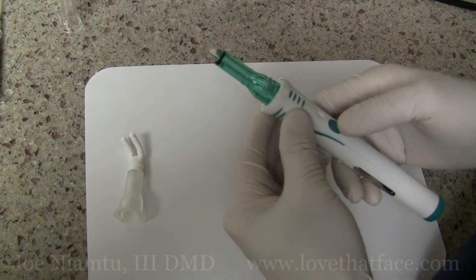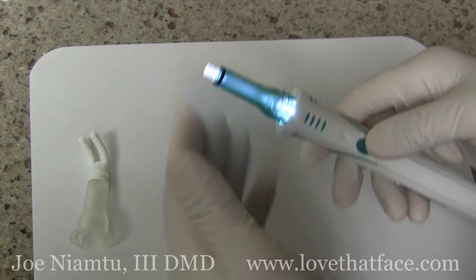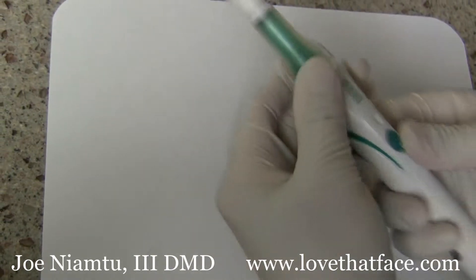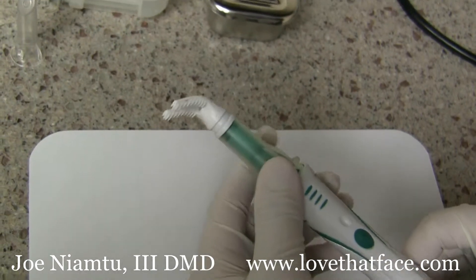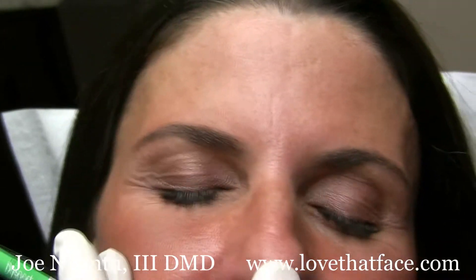This is the Dental Vibe. It's a device that pulsates and vibrates for anesthesia for injections. This is a tip that is used in dentistry to get inside the mouth and lift the lip up and to inject like this. We're going to use it today for some neurotoxin, the gate theory of pain control.